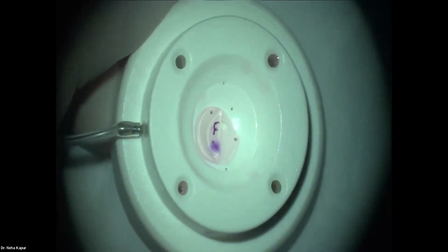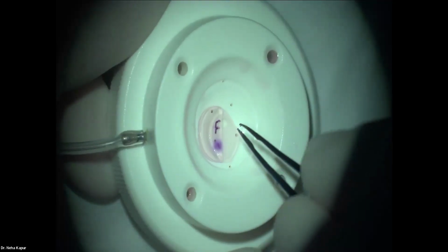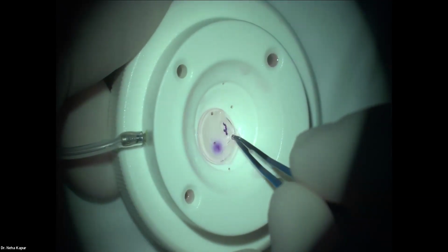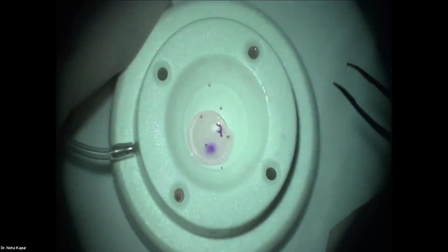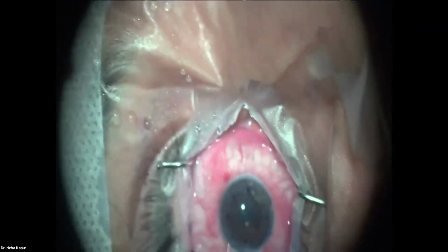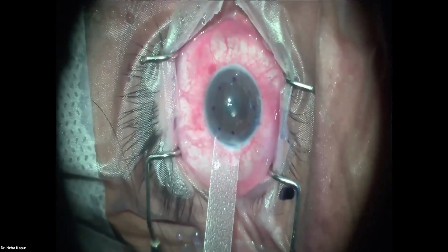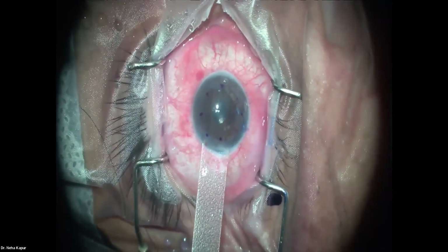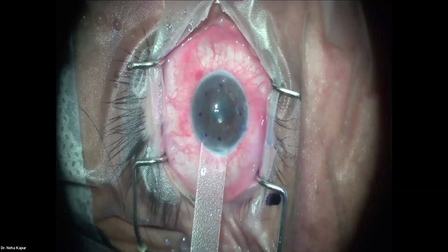And once this is done, we hold from the stromal side of the tissue and fold it back. Now our tissue is ready. It is marked. We keep it safe and go back on the eye. At this time, again, it's imperative to note that there should be no bubble inside the eye. Cornea wash.